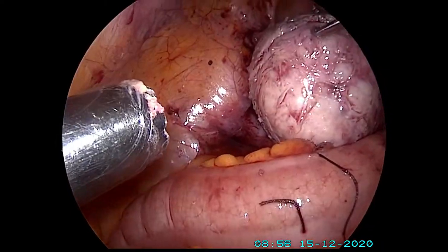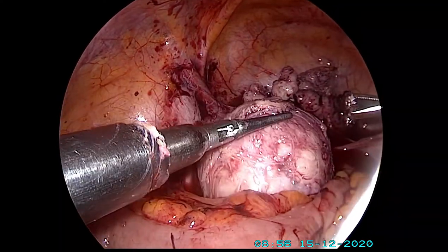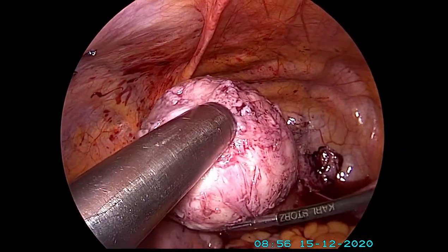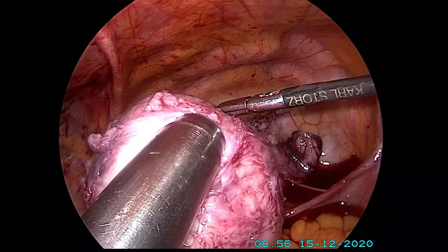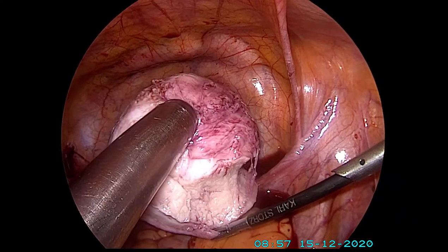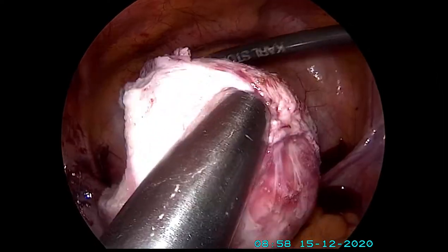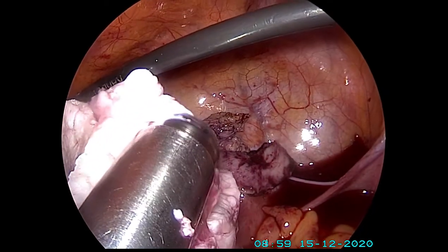Removal of the fibroids is now complete, but we have a huge fibroid inside the tummy and the holes that we've made on the surface are a maximum of one centimeter. So how do we take this huge fibroid out? We use an instrument called the morcellator. As you see the morcellator working here, it shreds the fibroids into small little pieces — the blade goes round and round, cutting long threads of the fibroid capsule, and each chunk is pulled outside through that 1 to 1.3 centimeter hole. This needs to be very carefully done because the blade is extremely sharp and must not touch any other surface or tissue inside the tummy except the fibroid being cut.